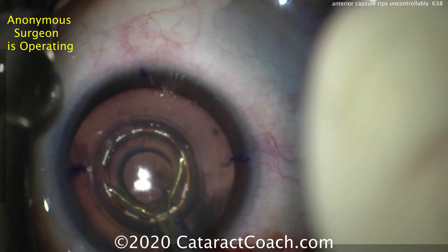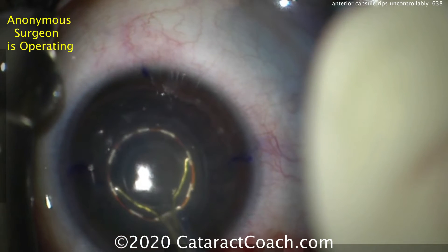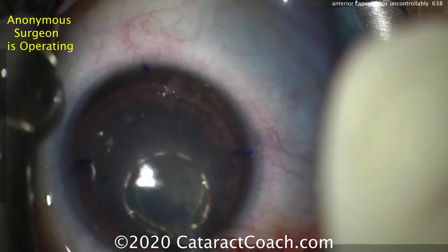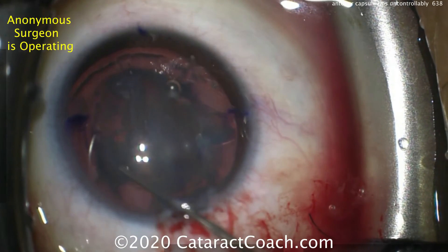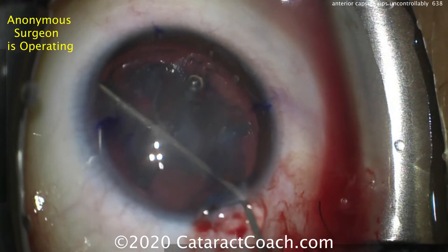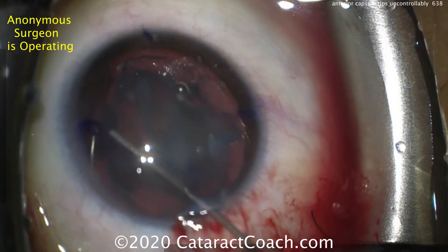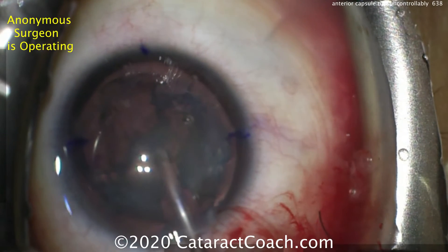And when the device fires — there it goes. The nucleus becomes more opaque, and it's not exactly clear what's happened here. But when a little bit of hydrodissection is attempted, the capsule doesn't look normal. In fact, it's ripped, and it ripped in an uncontrolled manner.